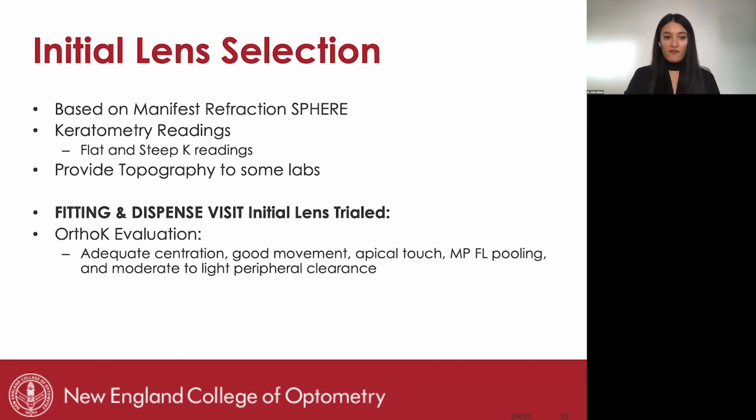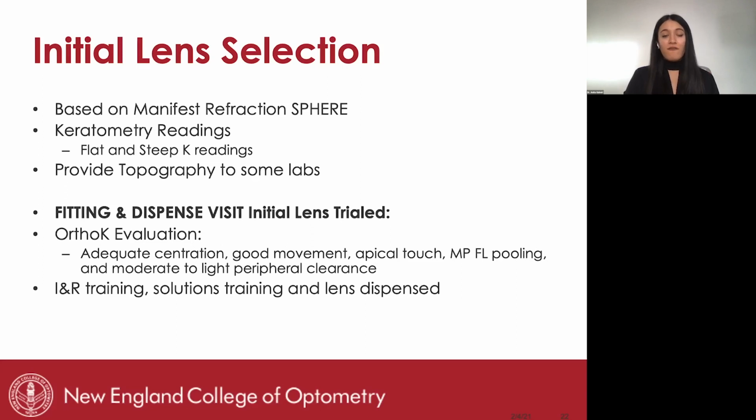I make sure that I have good centration, good movement, that apical touch, mid-peripheral pooling, and I'll show you guys examples of what the ideal lens should look like here. And then we do insertion removal or application removal training same day. We train them on solutions, cleaning, and things like that, and we dispense the lens same day. So 99% of the time, the first lens that I order, I dispense. Very, very rarely does that lens not fit appropriately and I have to actually change it.